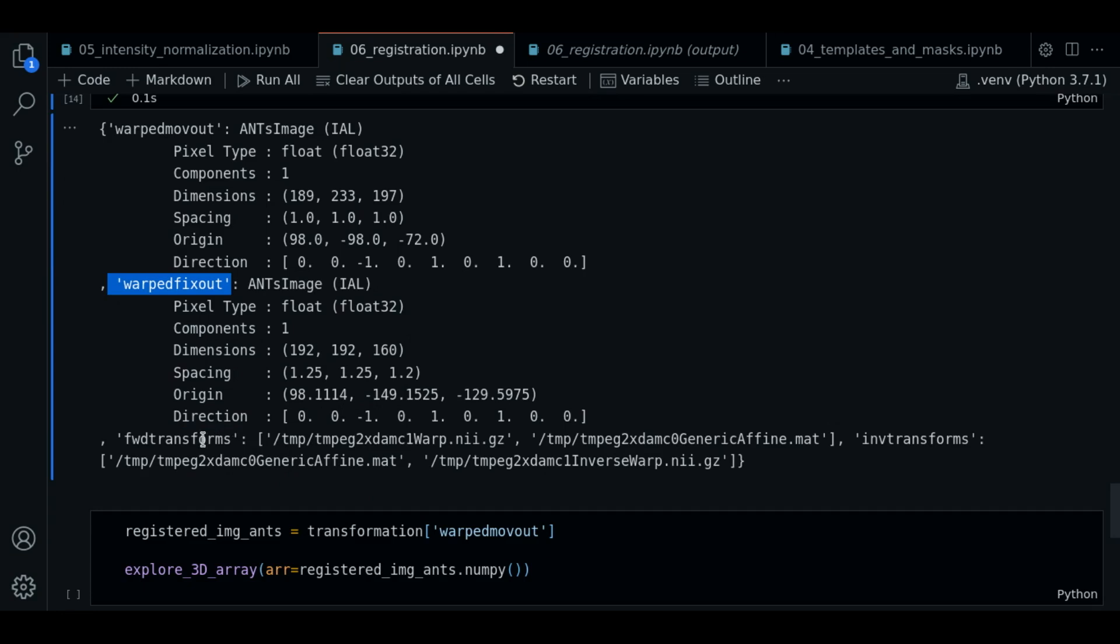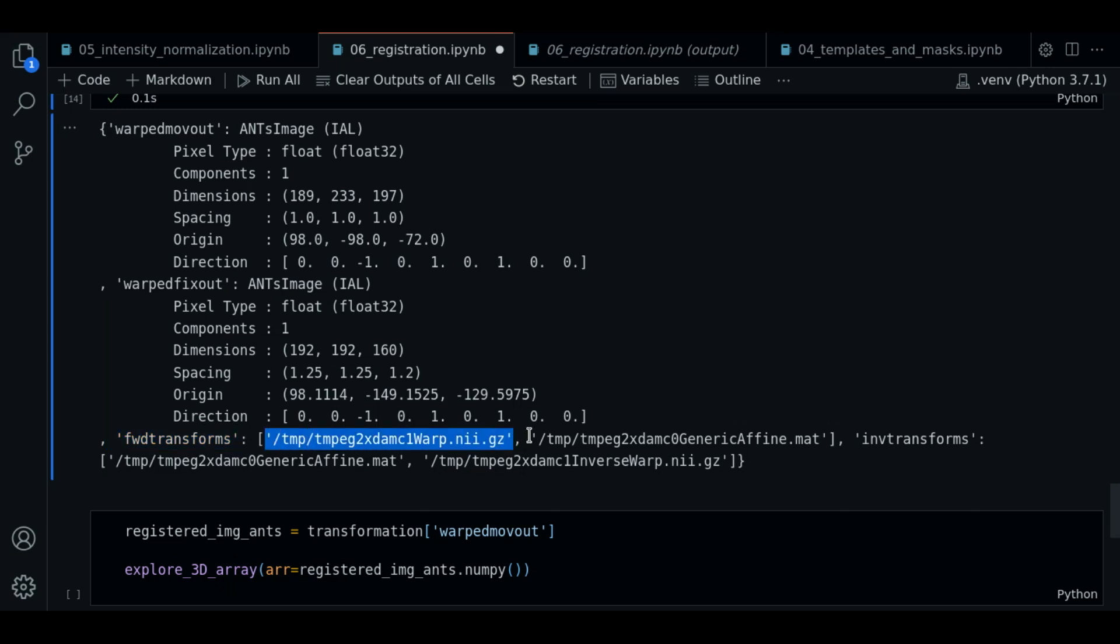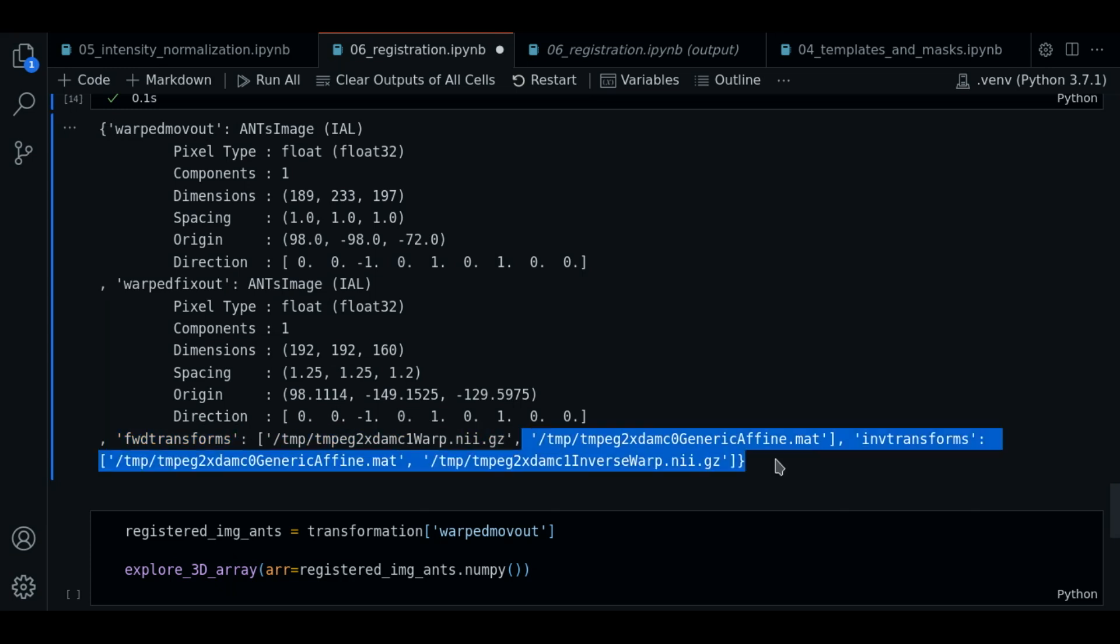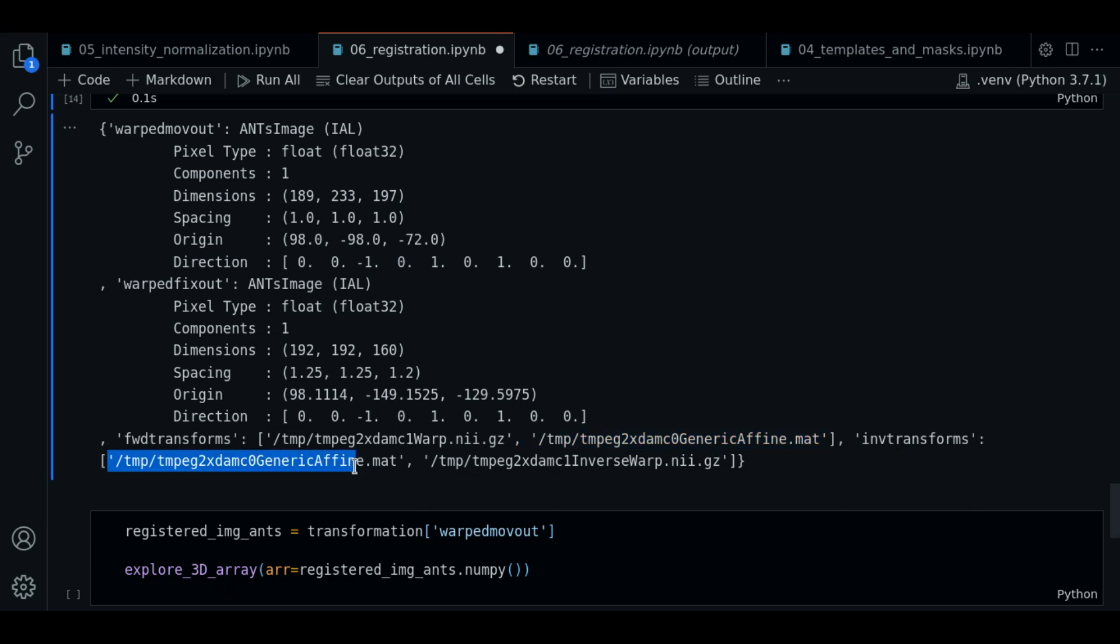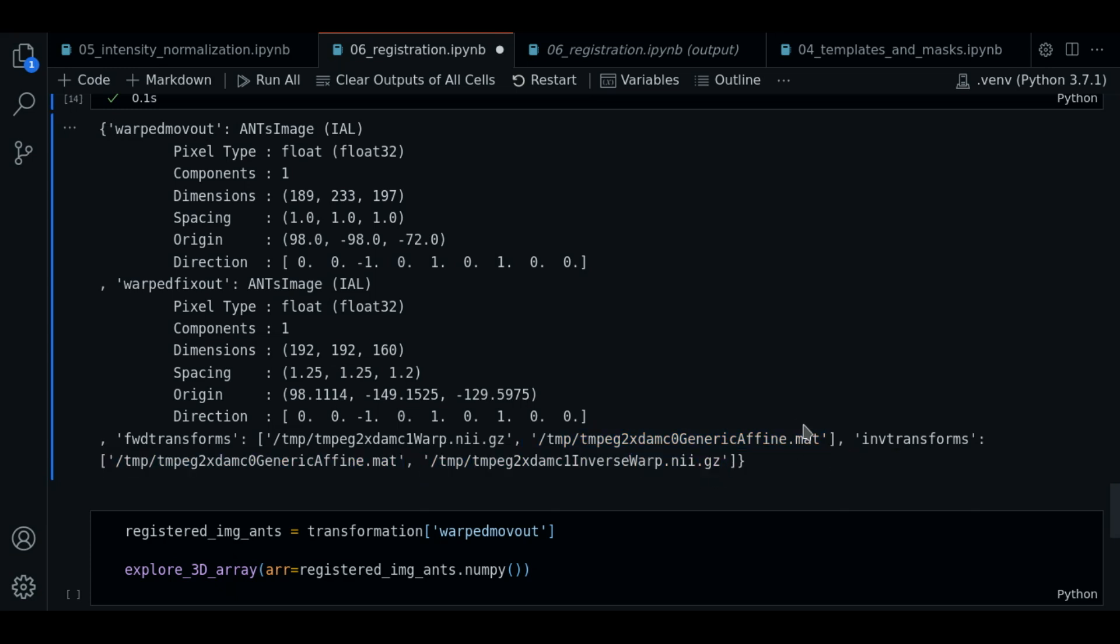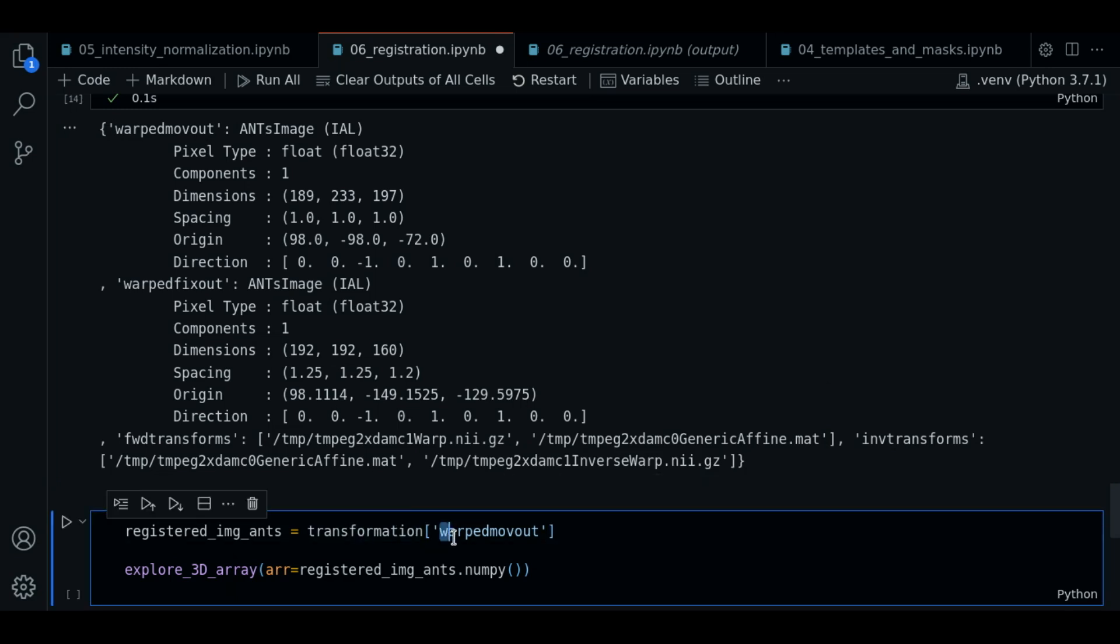We also have this output warped_fixedout. We have the output of fwdtransforms. These are the transformations files that I talked to you about earlier. We also have invtransforms. So these are the paths where the files were placed.